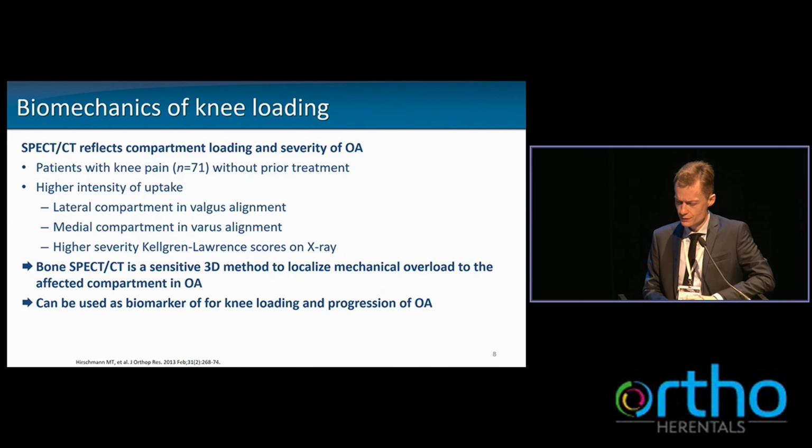And the basis for this finding was laid down a few years ago in this paper, showing that patients who had higher levels of uptake on bone scan did actually translate very well, or could be explained by the biomechanics of these knees, whether they were in valgus or varus alignments, and that correlated with the level of degenerative disease that was seen on X-ray.